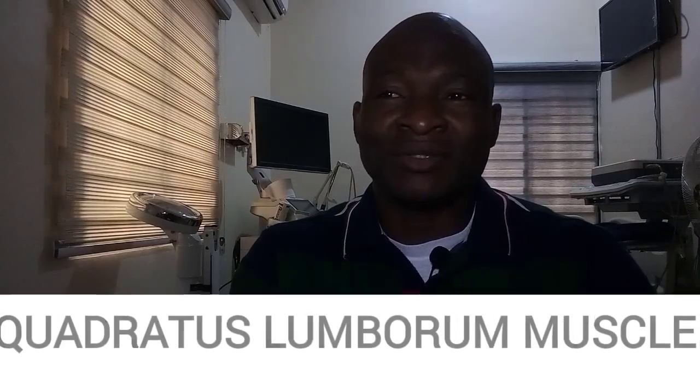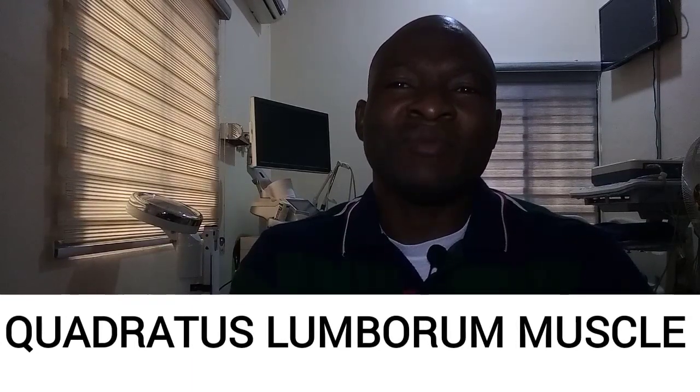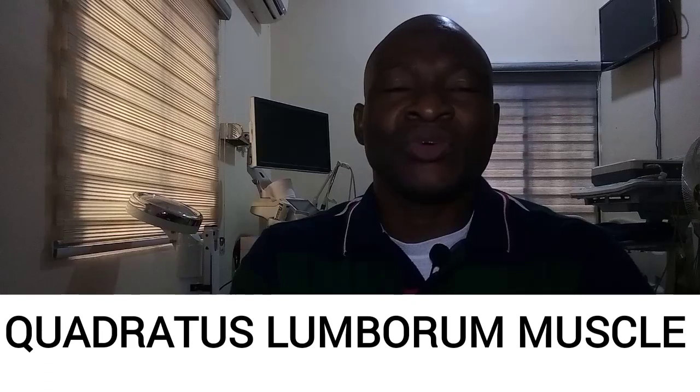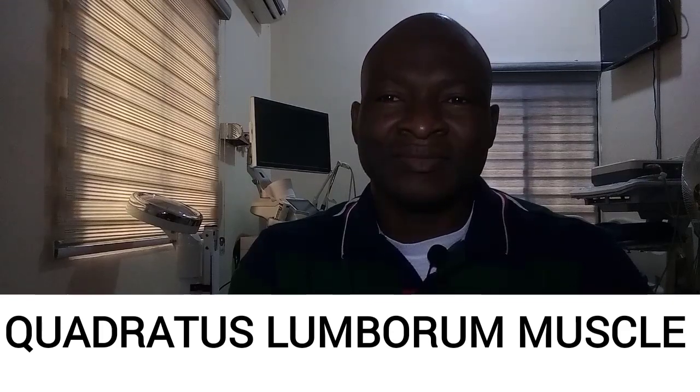So scanning through contraction and relaxation of the muscle may help detect abnormalities. So let's look at some of them. For example, quadratus lumborum muscle. This muscle originates from the lower border of the 12th rib and transverse process of the lumbar vertebrae. They insert into the iliac crest.